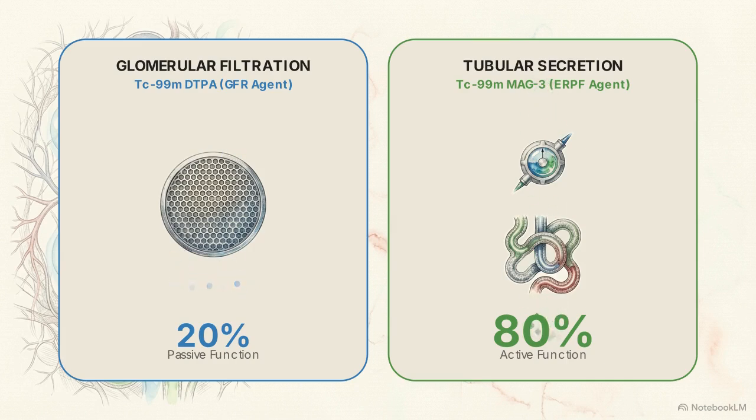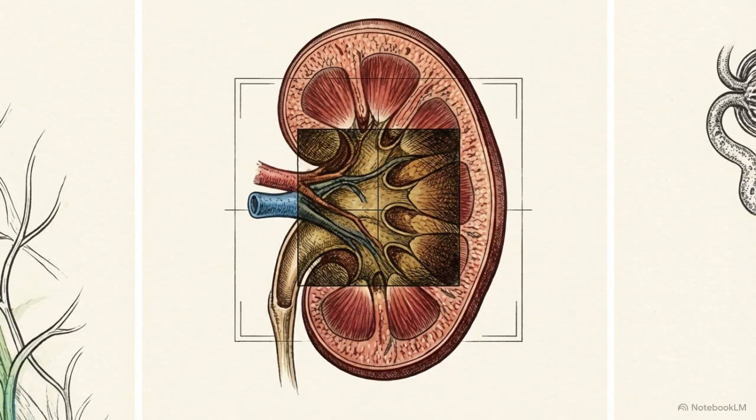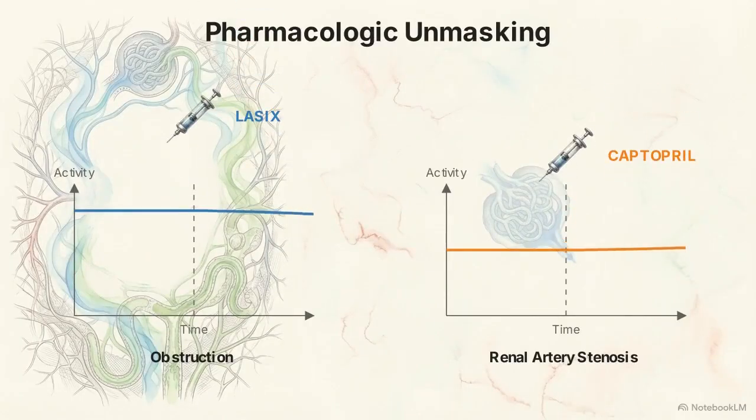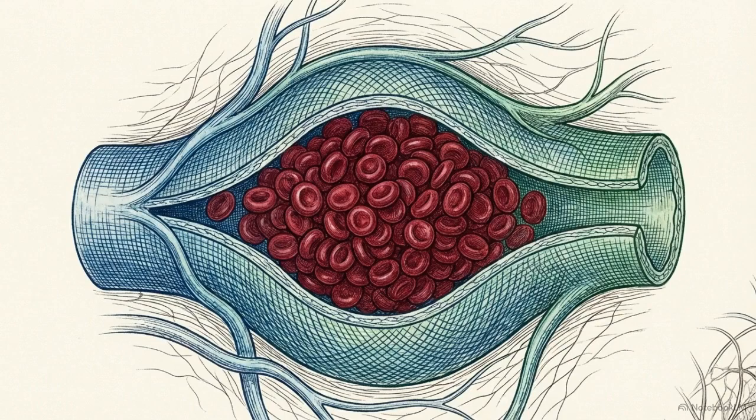Once the temporal scan begins, we have to assume that baseline physiology is a compensatory mirage, hiding underlying deficits. This is why systemic stress tests like the Lasix and captopril challenges are mandatory. They break physical and chemical compensations, forcing the true pathology to the surface.